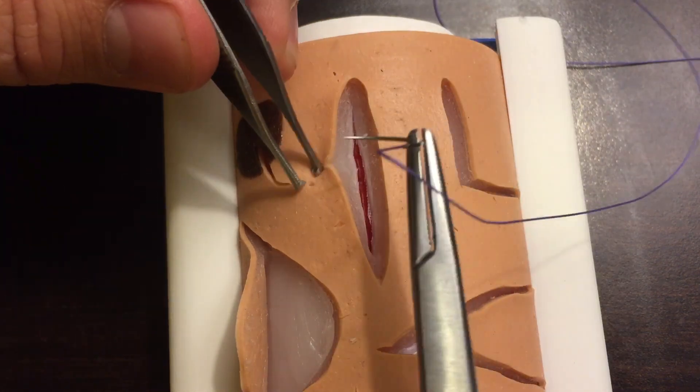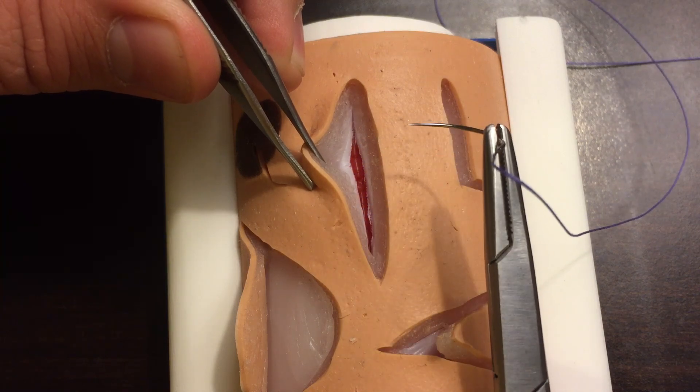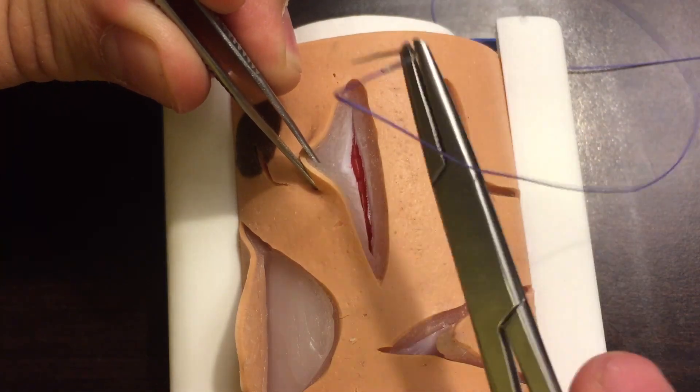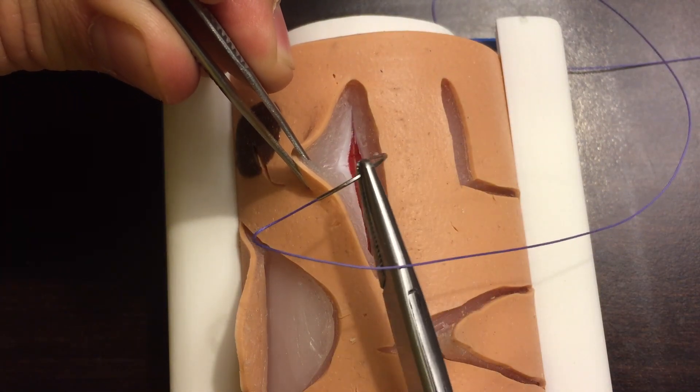That will interrupt the healing of the skin. So oftentimes we're going to throw our vicryl suture as an inverted throw. What I mean by that is it's going to be like a simple interrupted but upside down, so that when we're all said and done and our knot is tied, the knot is deep — the knot is on the opposite side of the fascia.